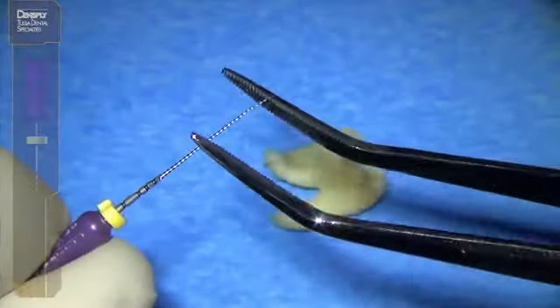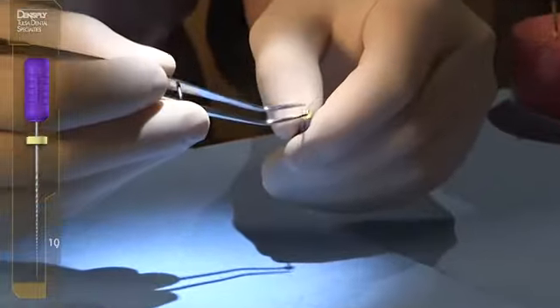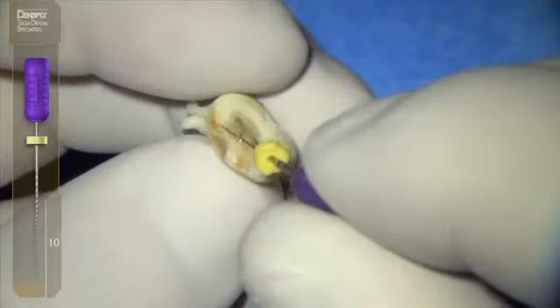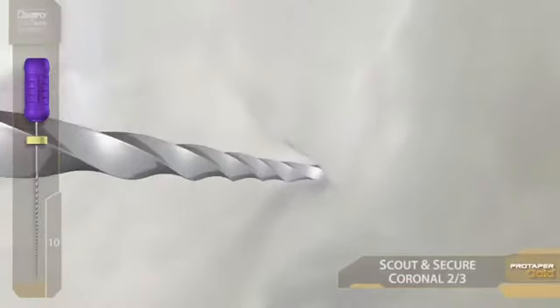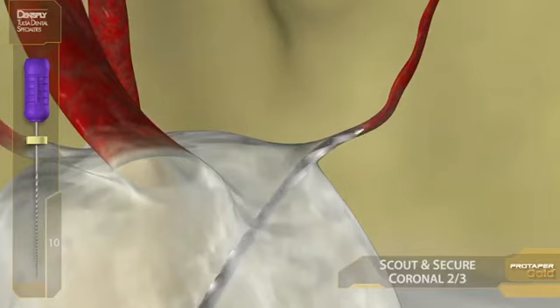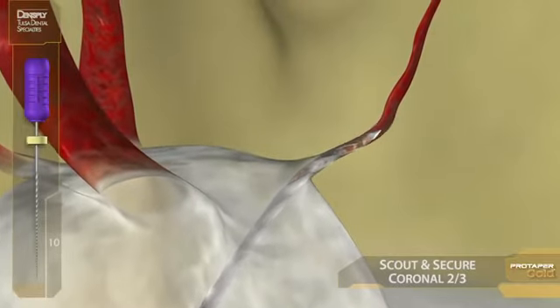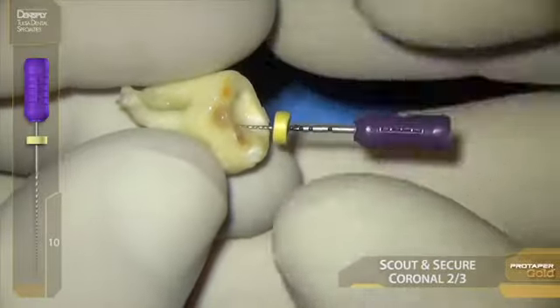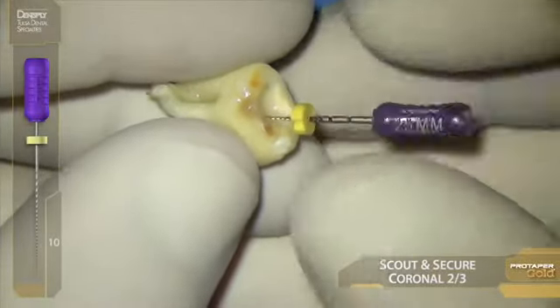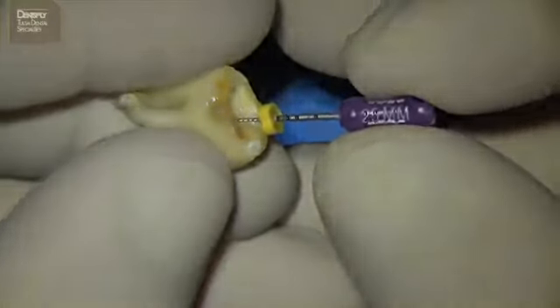So we pre-curve a 10 file to make it a smart file, and in a sea of sodium hypochlorite, slide into the distal buccal simply to explore, investigate. We're not in a hurry. We're looking for booby traps. We're looking for local knowledge. And what we're discovering early is the dentinal triangle is restrictive. So without attempting to go deeper or beyond that dentinal triangle, we bring in the rotary system to remove the triangle and then to shape and make a final preparation.